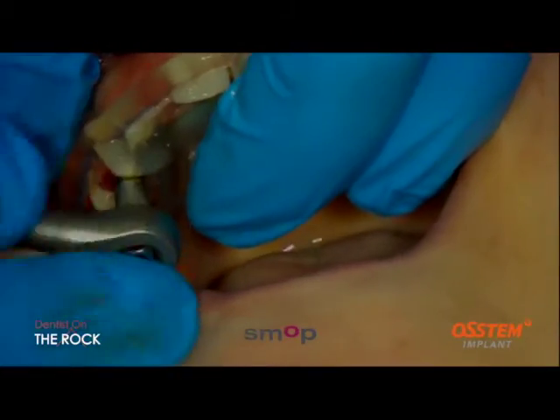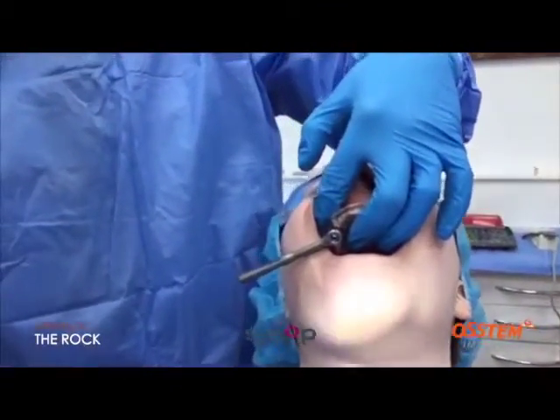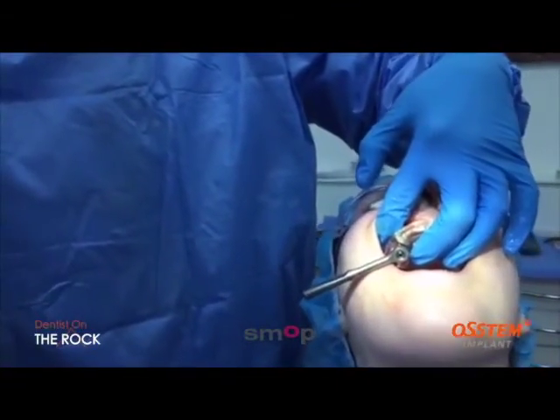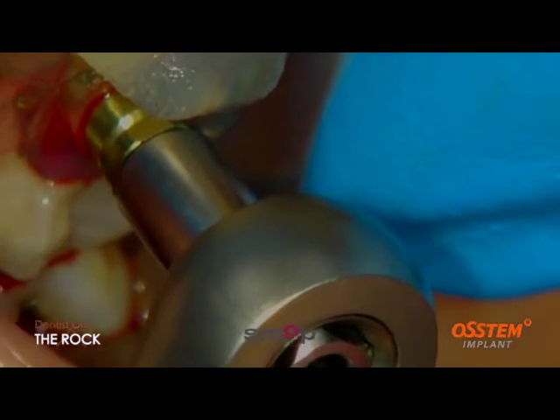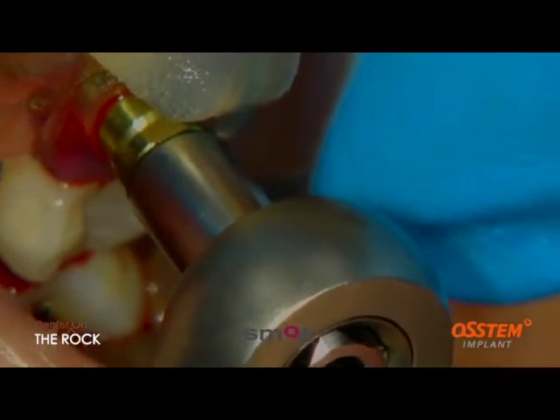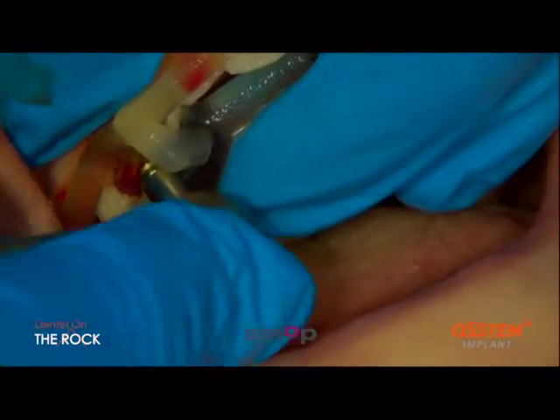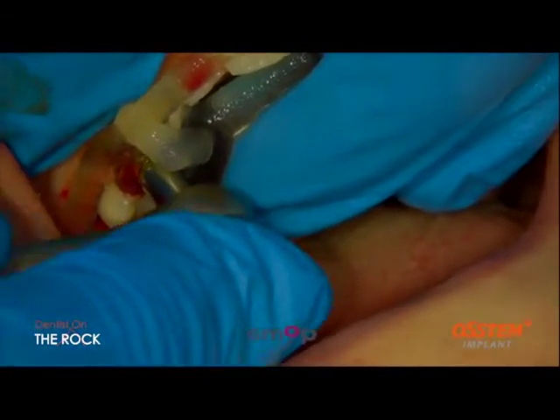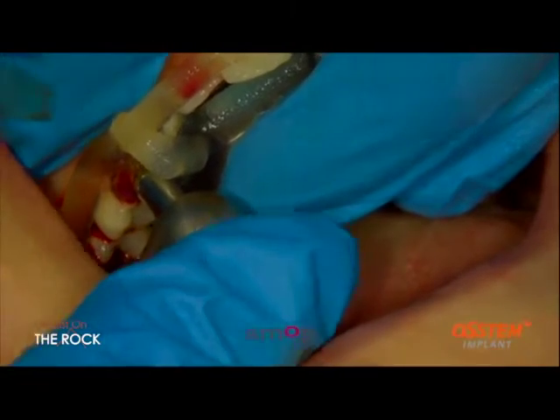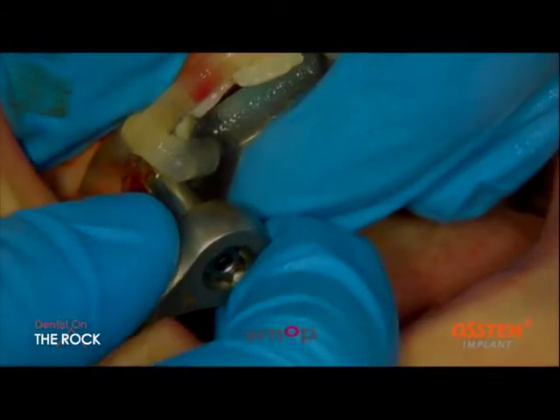and I don't know if you'll be able to see, but I'm going to try and just show you from the side. There is a little depth stopper on the guide mount. Now, when I'm taking this down, it will just go very gently and easily down until that depth stopper reaches the edge of the guide. And I take it very slowly until I just feel it hitting that, only just, and then I'll know it's exactly where I planned it to be.